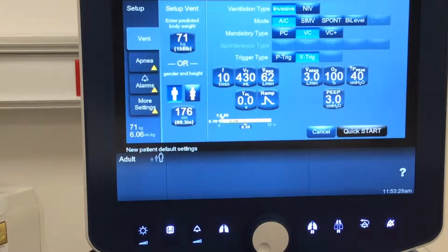So if I were to start ventilation right now, it's going to result in a 1 to 6.89 I to E. Okay, so we know that for most of our patients, it takes twice as long to get the air out as it does to get the air in. So at a bare minimum, in most circumstances, we want to maintain at least a 1 to 2 I to E ratio, although we would rather have far more than enough time to exhale rather than not enough. Okay, there's a lot of problems with not having enough time for exhalation, most notably air trapping and auto PEEP, and we'll talk about what that does. But there is no problem with having an extra amount of time for exhalation. It has no negative implications. That is a major positive.